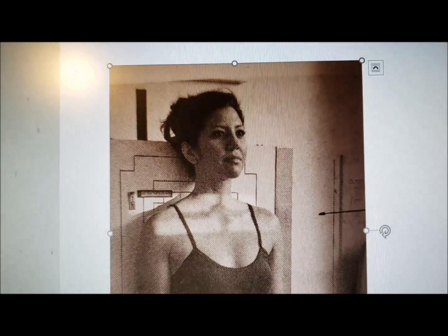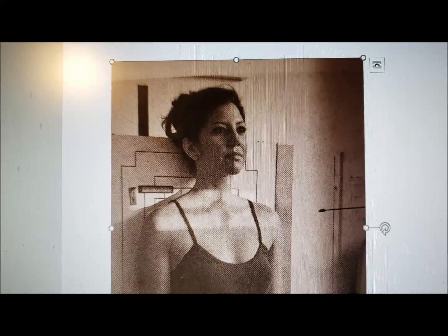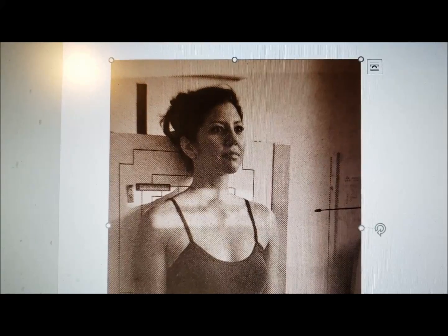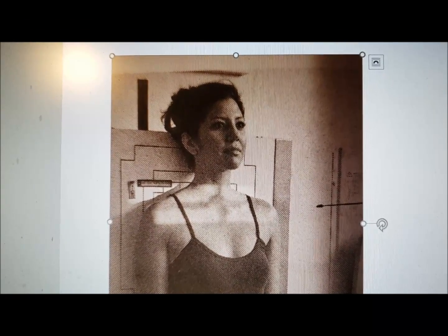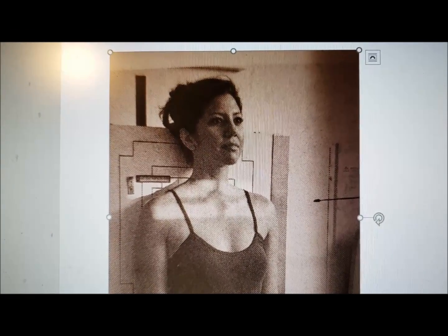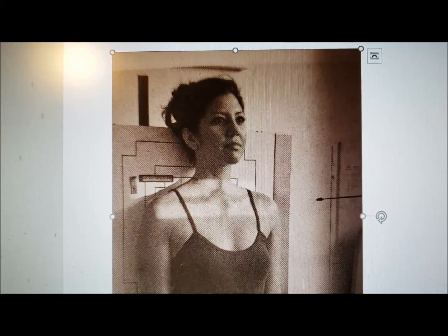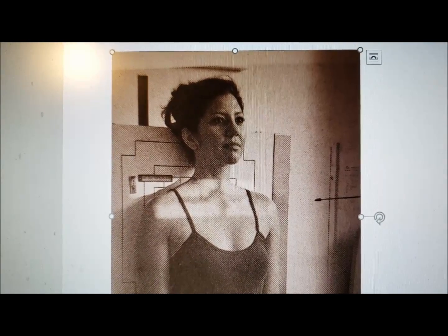Finally, I want to talk about the last position, which involves the scapula but is technically not a scapular view, and this would be the AC joints. Seeing how it has the acromion, I will include this in my report. For the AC joint, I would use a technique of about 80 kV and 5 mAs, and this is to view the right and left AC joints, with the SC joints also included.